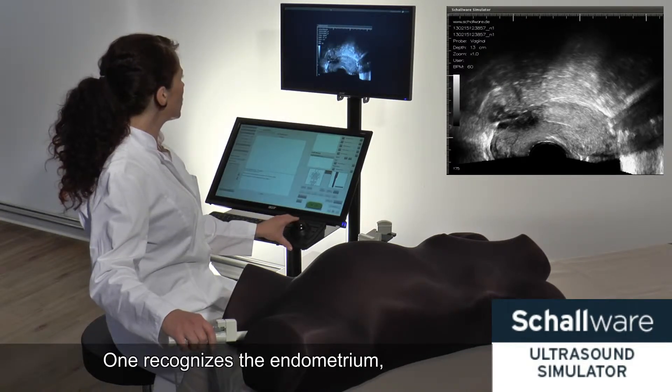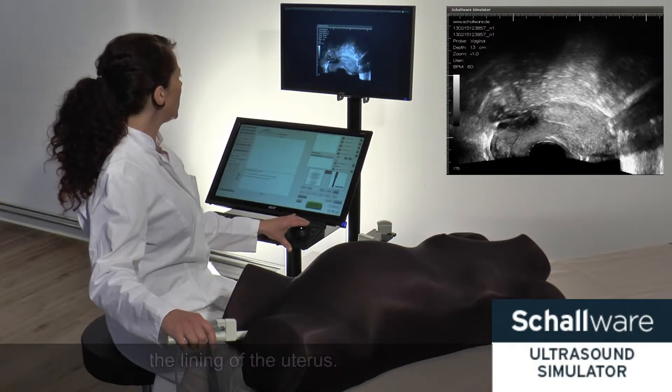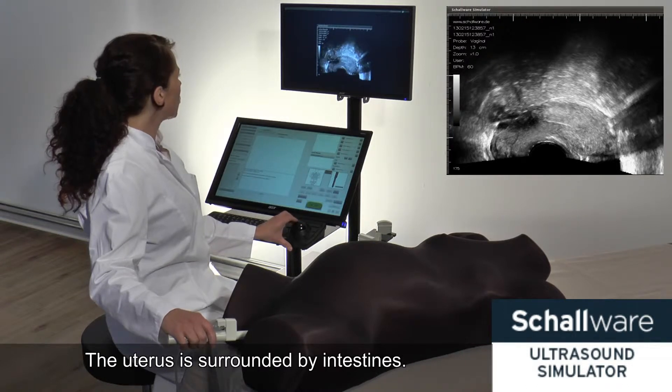One recognizes the endometrium, the lining of the uterus. The uterus is surrounded by intestines.